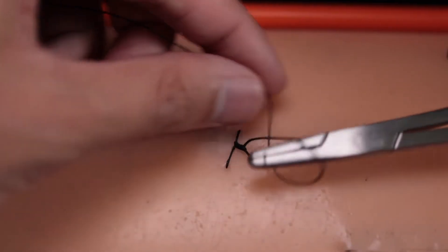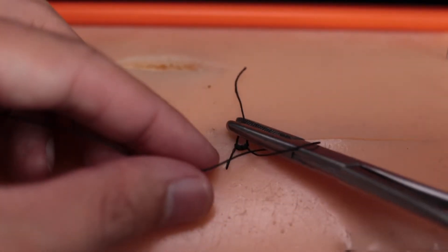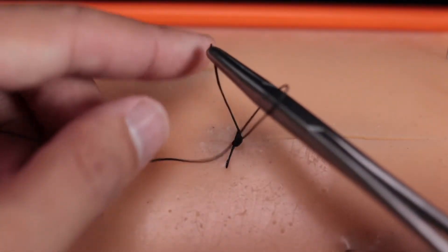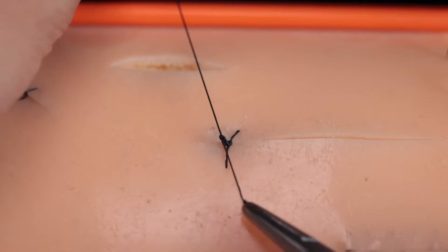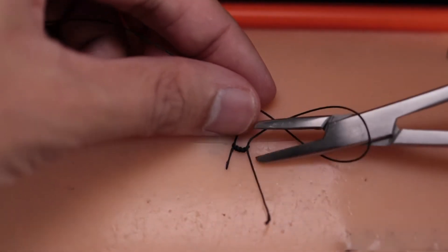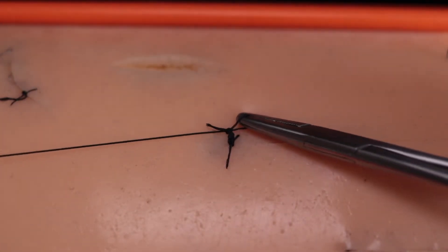Here are some tips to make things a little easier. You definitely want to grab the end of the free suture and not the bottom, like I'm showing. So you grab the free end — that way when you pull through, it goes through nicely. If you grab the bottom, you're at risk of creating just a little knot like that.